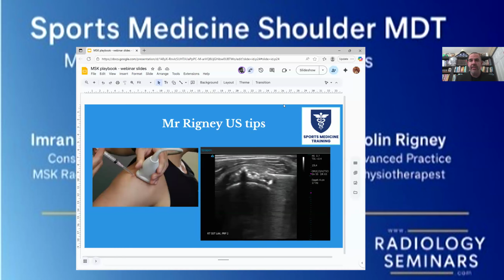This particular slide is a PRP injection. We did a barbotage weeks before, and then we're going to fill it with platelet-rich plasma. So this is good discussion for perhaps the end of this or another time, with how do you deal with the findings, right? But I wanted to show everybody one particular approach we take to deal with these things.